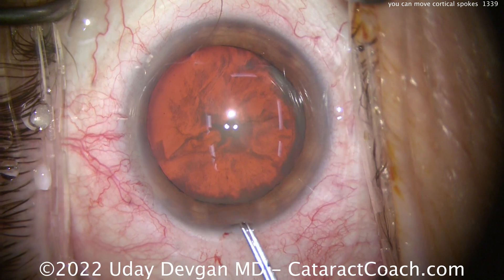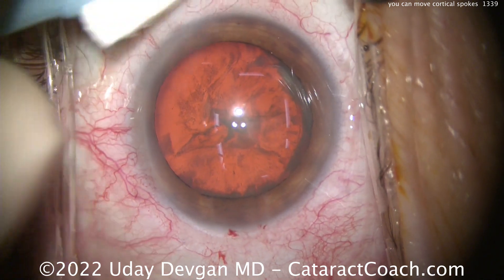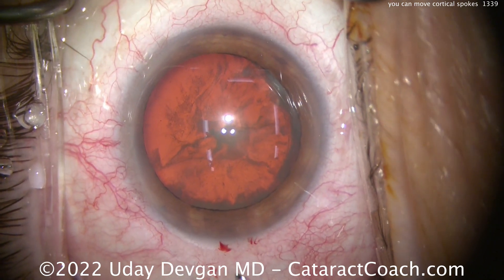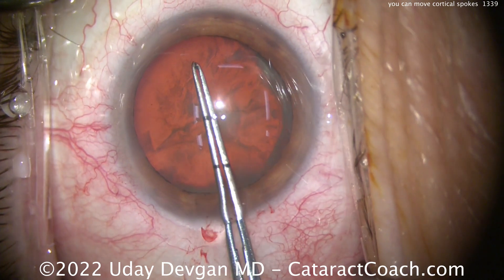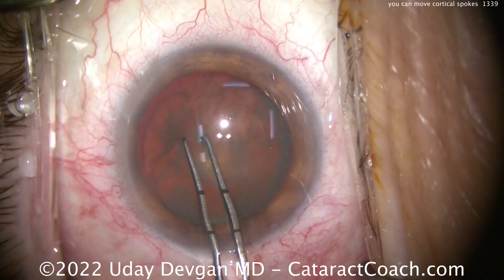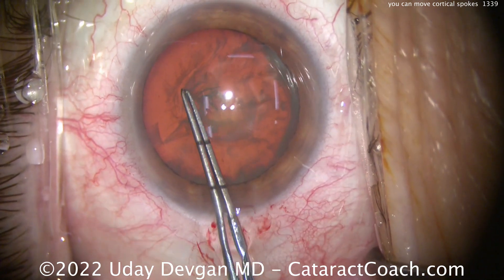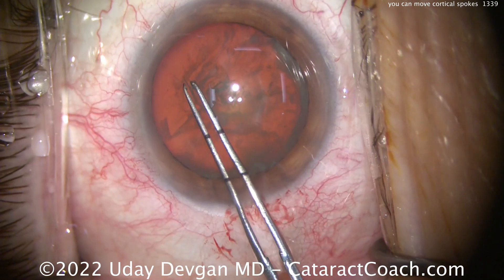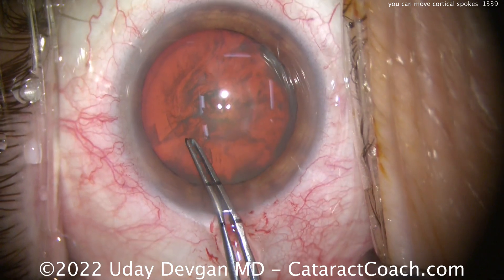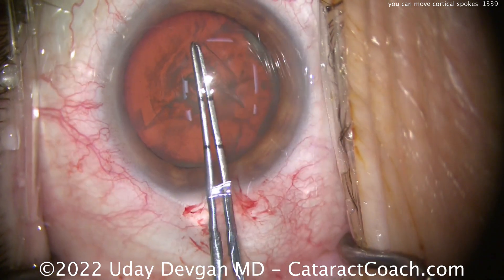So now we'll start the capsulorexis here. A little bit of that milky lens material may ooze out, but it's not too much — very little. This is not a completely opacified or intumescent white cataract. We'll poke here in the center and start our rexis, measuring out in my mind what five millimeters is going to look like. Starting the rexis and we'll get it flipped over. You'll see we'll be able to create a really nice rexis, and there's the spot where we previously had a cortical spoke — but we have great visualization all the way through there.